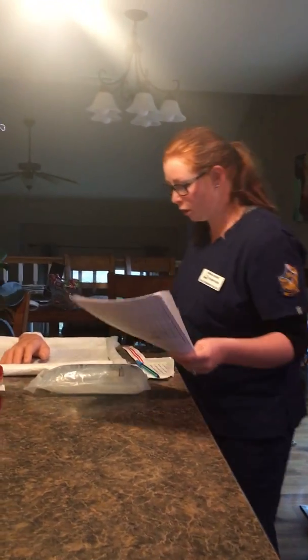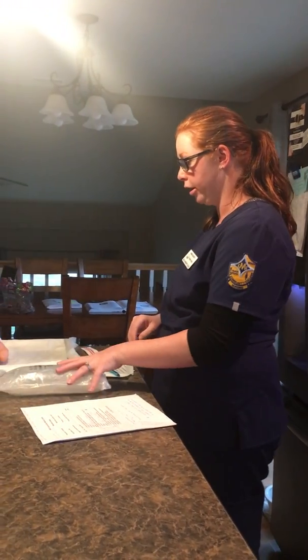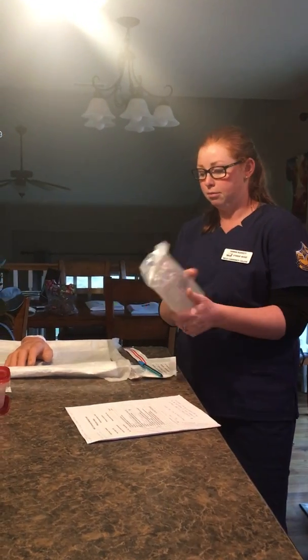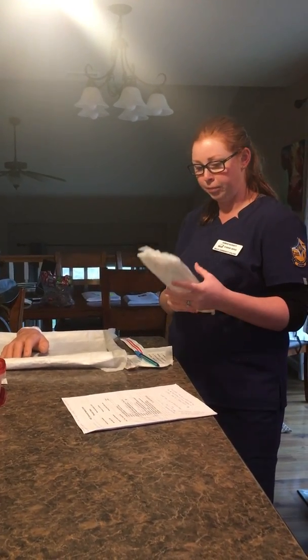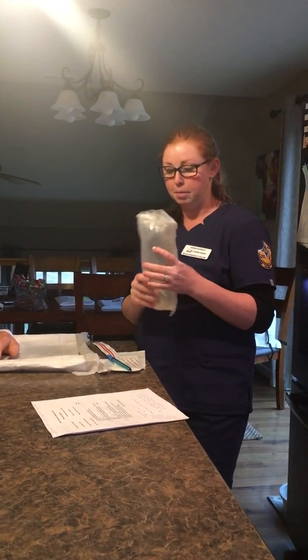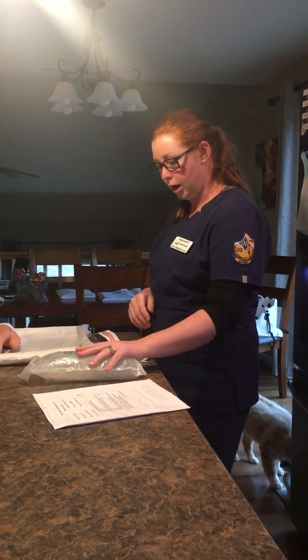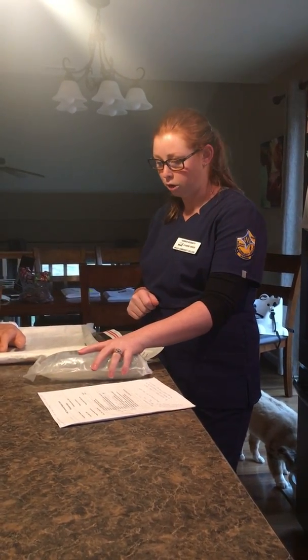So we're going to make sure that we have all of our materials here. I have my solution. I definitely want to make sure that it's not expired. I want to make sure it's the right color. I want to make sure there aren't any particulates in the bag, and that the bag is intact and we're good to go to use that. And then I'm gonna also want to make sure that it's the correct solution for the doctor's order.